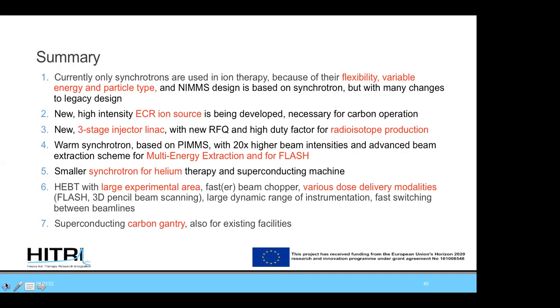The energy at which stripping is efficient starts at around 4 MeV per nucleon. Therefore, it has to be done at the end of the LINAC in principle. And how is it done? It's very simple. It's just a very thin carbon foil of a few tens of micrometers thickness. The beam just goes through, and the additional electrons are removed. But also for hydrogen or for protons, actually the dissociation of the particles takes place there.